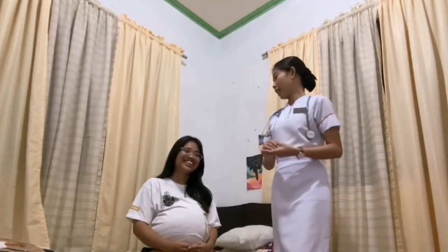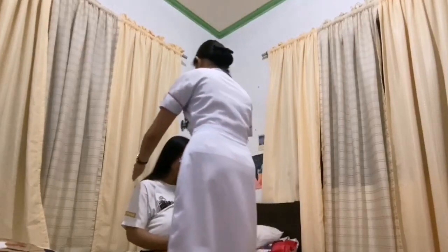This is in order to facilitate accurate assessment, providing comfort. Flexed knees to relieve tension of abdominal musculature. So, ma'am, you can lay down na po.